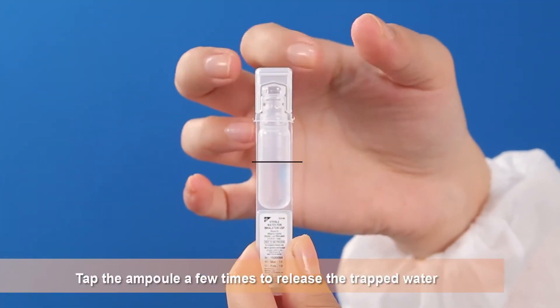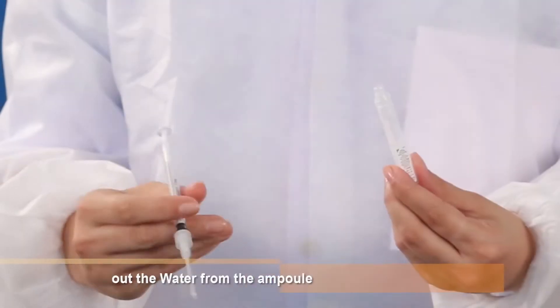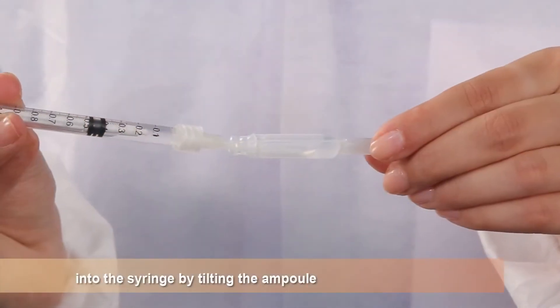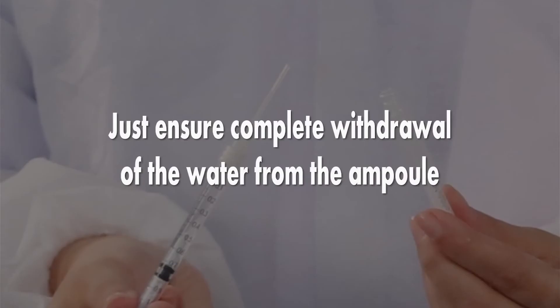Visually examine if there is water trapped in the top of the container. Tap the ampoule a few times to release the trapped water. Open the ampoule by twisting off the top. Draw out the water from the ampoule by tilting the ampoule. It does not matter if there are any air bubbles in the water. Just ensure complete withdrawal of the water from the ampoule.